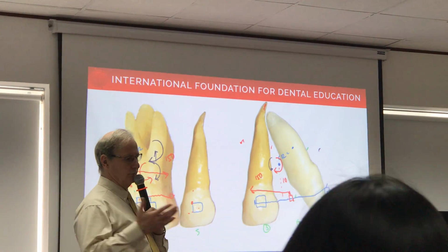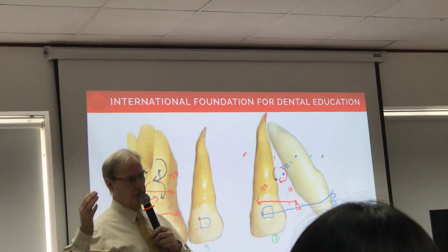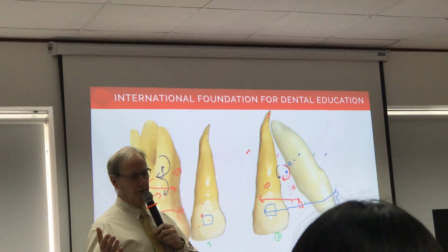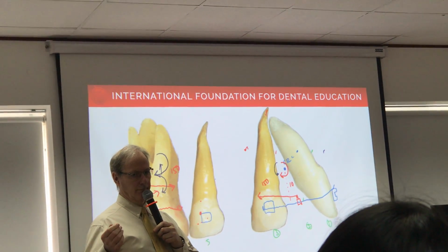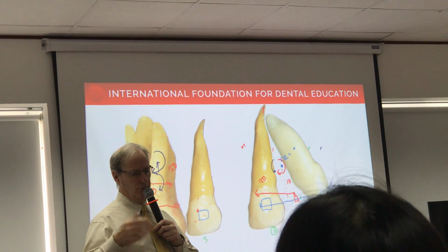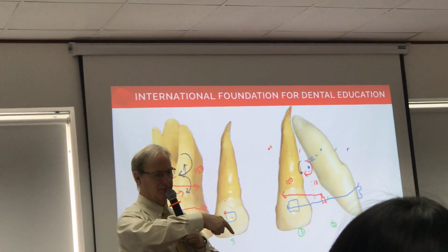Because too many courses you take will give you the sequence, ta ta ta ta, and they show you great cases. You know why? Chính vì thế mà chúng ta nhớ là chúng ta phải vạch ra cái đường dịch chuyển răng theo trình tự. Because the case fits the wire sequence. Then you do the same sequence on the next patient, doesn't work.